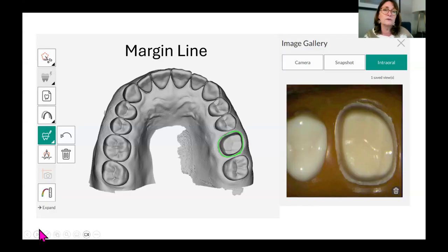usually they were CEREC users or introduced to digital technology and did same-day dentistry or design, perhaps even in dental school. And they really gravitated towards that and they like that. But for the rest of the dentists, I think they struggle at marking the margin.